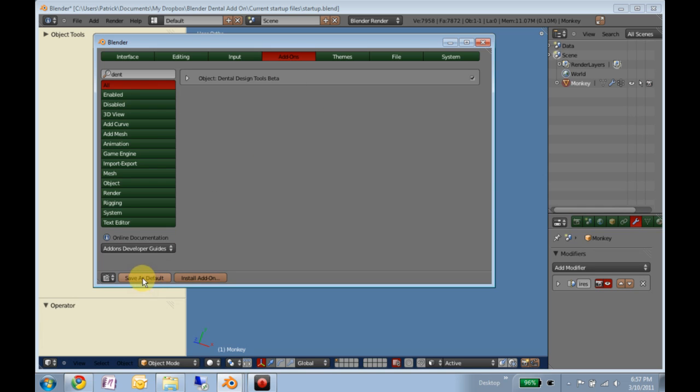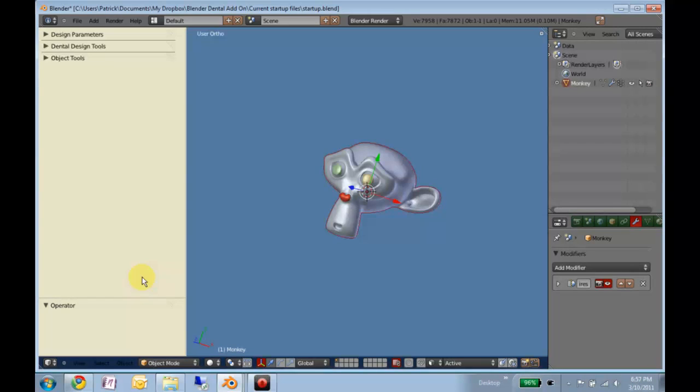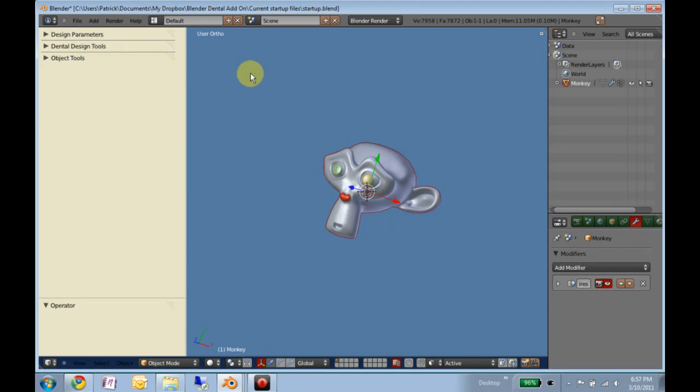But you have to do this first. Save as default. So that saves everything - your colors, which tools are added on, things like that.